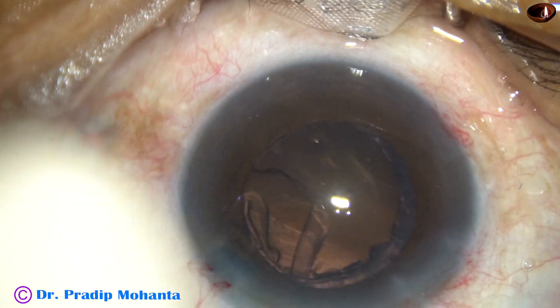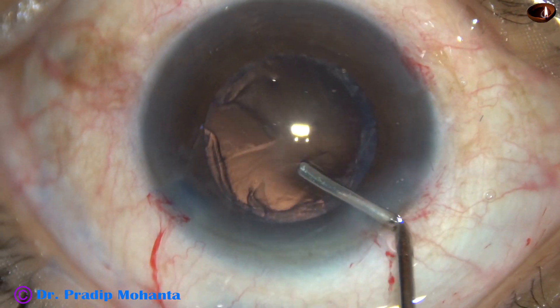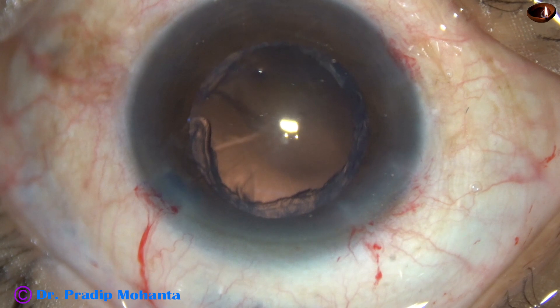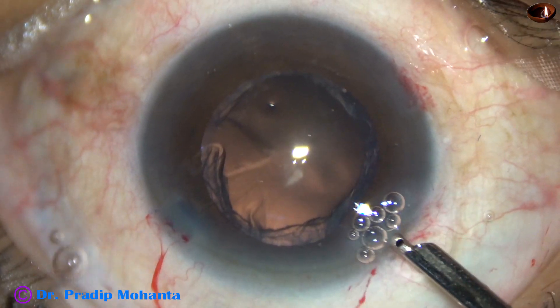So this is a beautiful technique for soft cataracts. One must do a large rhexis. The size of the rhexis should be about 5.75 to 6 mm.